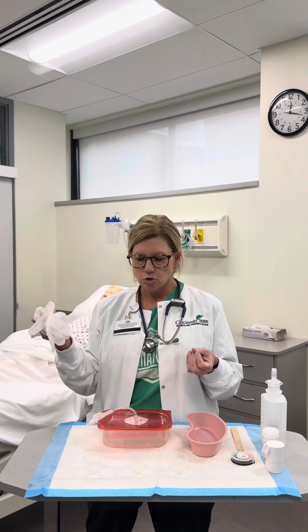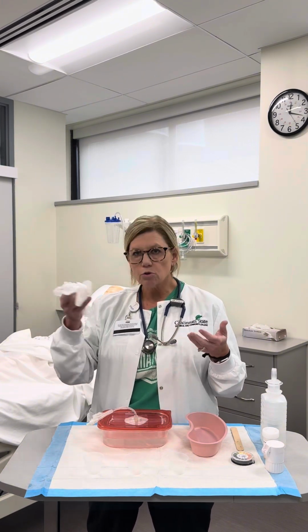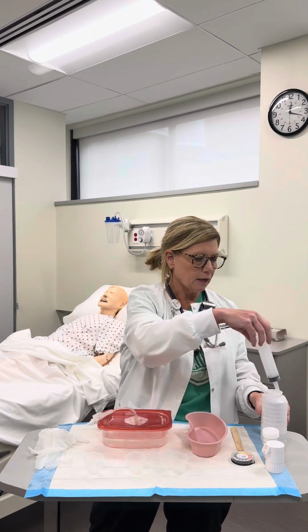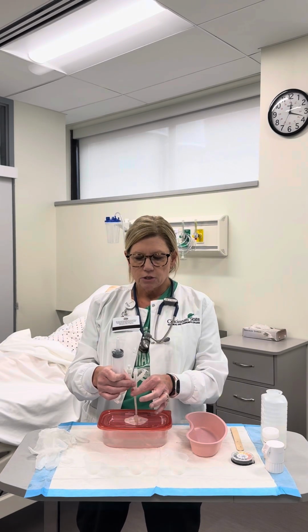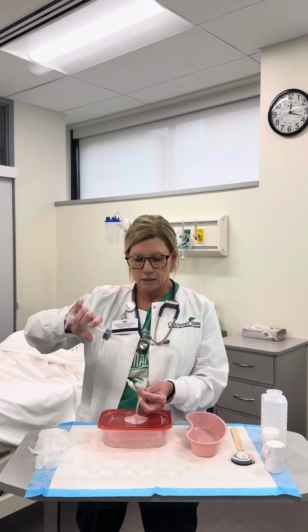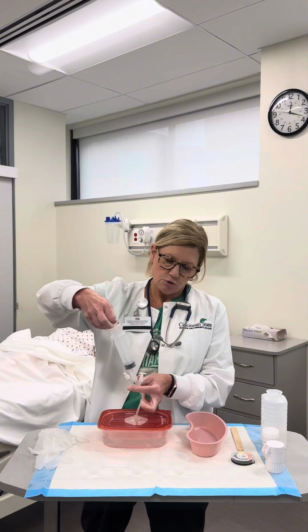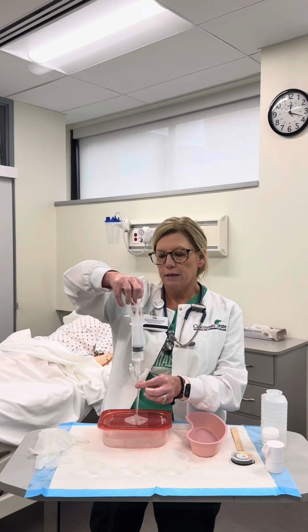Anytime I'm doing anything with the G-tube, I do want to make sure I have gloves on. So for the skill, either you can put gloves on or tell us that you would put your gloves on, okay? So first thing, I'm going to check my patient's residual. I'm going to take this tube and I want to pinch it, because when I take the cap off, I want to make sure that they're not getting air into their stomach. Go ahead, put the syringe in there, and then as soon as I pull that up, I can pull back the residual.